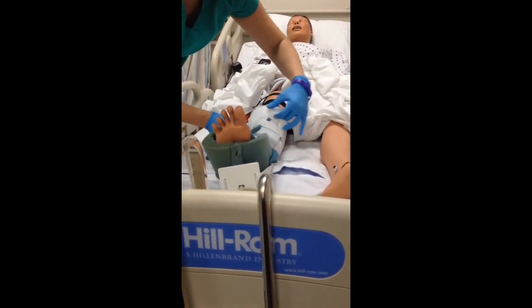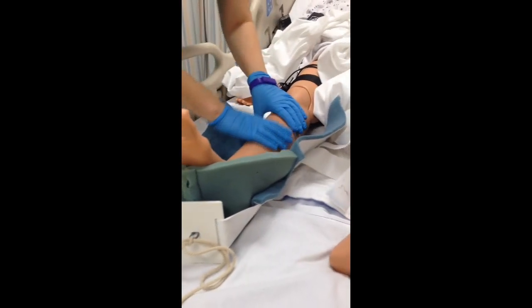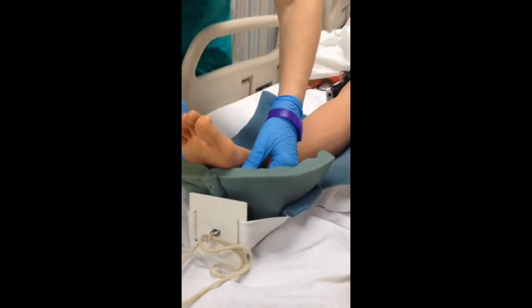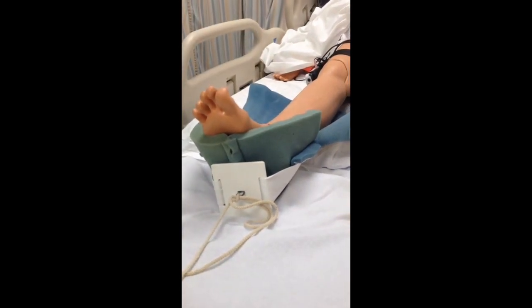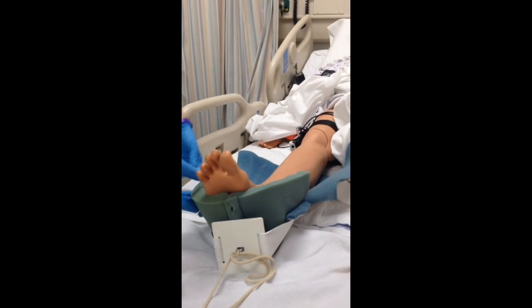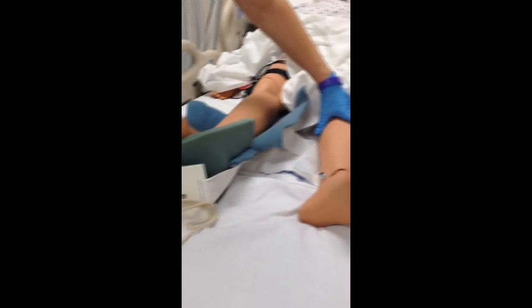We open it up and we're going to check for any edema, any redness. We're going to check under the heel to make sure there's no pressure ulcers building up, any redness or blistering. I don't see any redness. The temperature is good, there's no moisture, it's dry. Capillary refill is good. Comparing it to the other side — it seems to be the same. Everything's equal bilaterally.